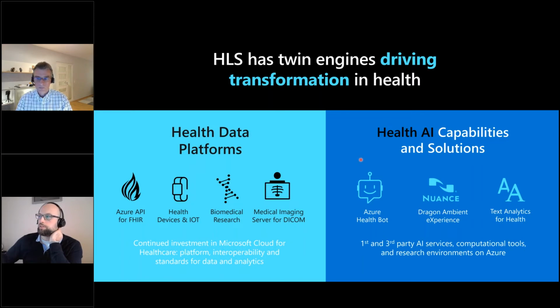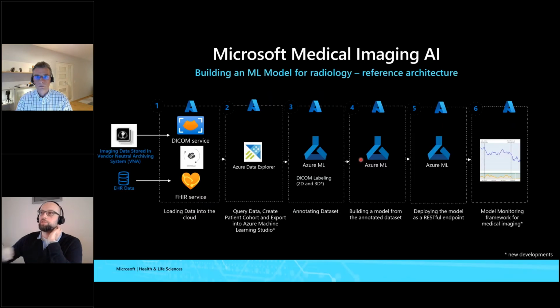So I lead this team, and we're looking at improving the lives of people who are building their machine learning models using Azure tools. You have seen so far the tool called Azure Machine Learning, which is our generic tool for building machine learning models in the cloud. And we'll look at things such as this reference architecture for MLOps in the cloud, which answers the question, how do you connect Azure Machine Learning to other steps of the process?